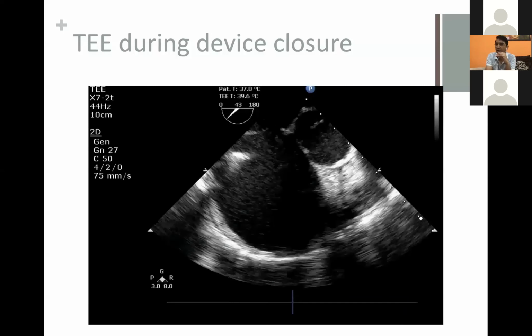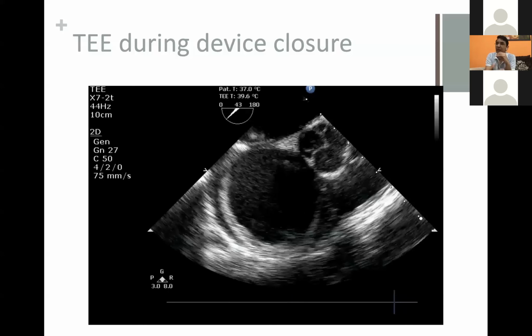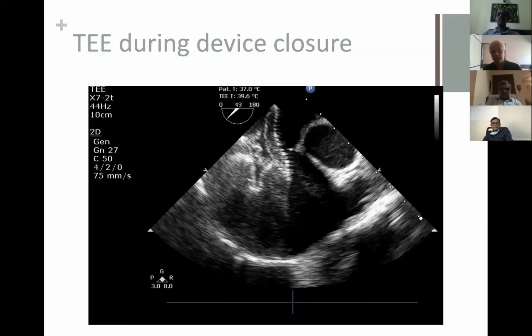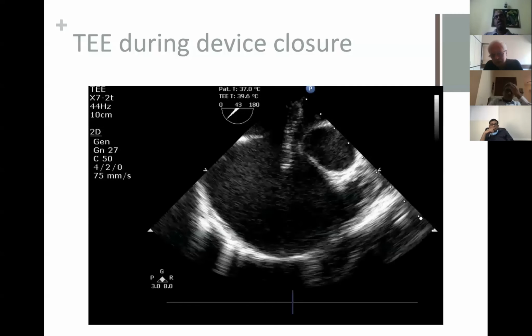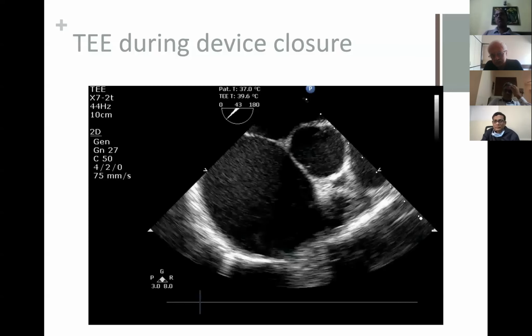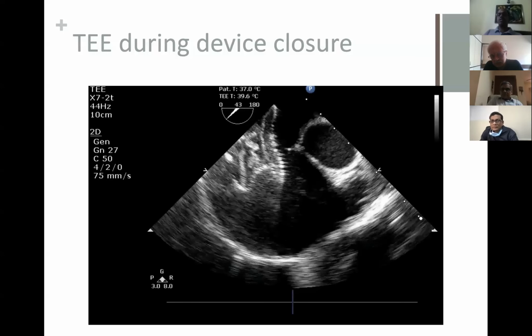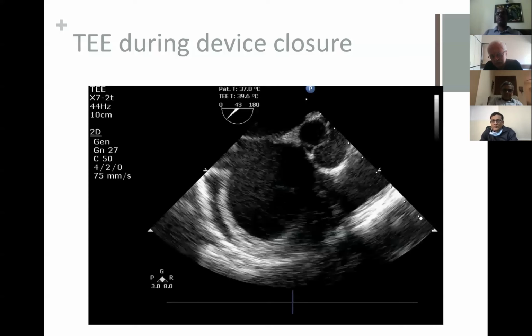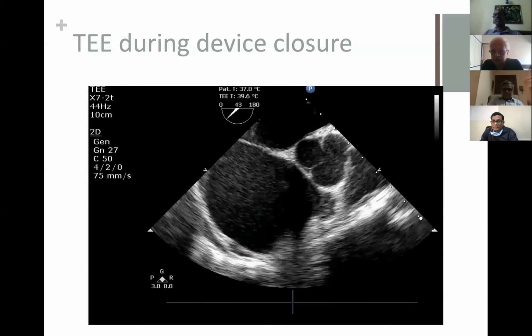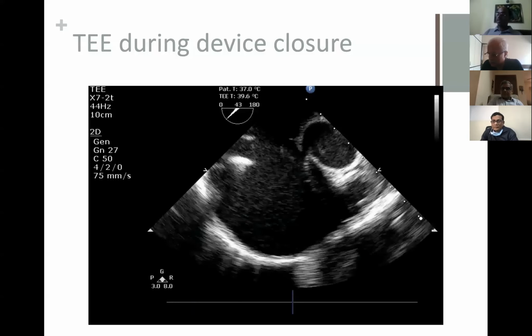I won't go for it for the sizing of the ASD. I was just showing it to help all of us understand the relations of the ASD. All these three-dimensional models increase the perspective and the understanding of the operator rather than providing a perfect spatial resolution. And yes, a simple transesophageal echo, or in smaller patients a transthoracic echocardiogram, today stands as the best spatial resolution for assessing an ASD.